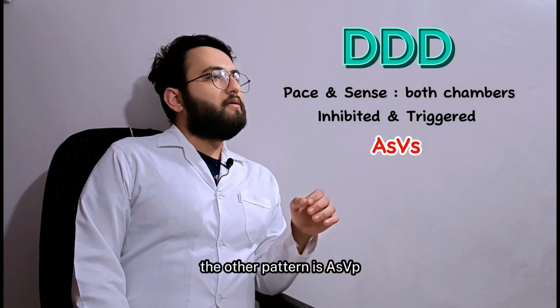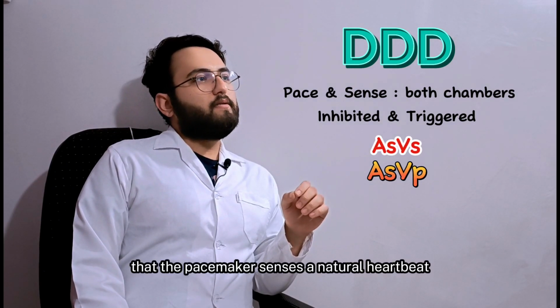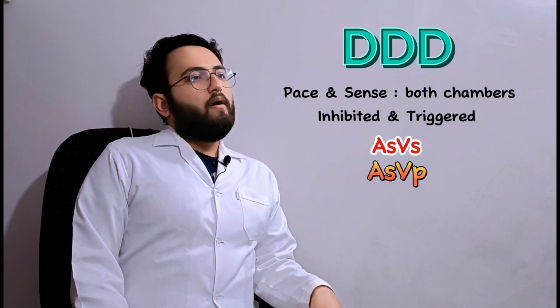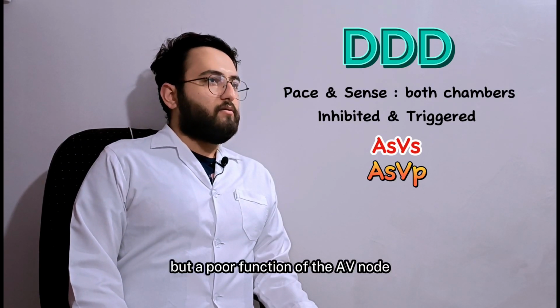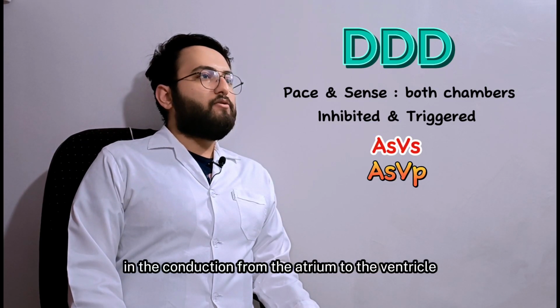The other pattern is ASVP. This means that the pacemaker senses a natural heartbeat in the atrium, but it paces the ventricle. This is used when the patient has a good function of the sinus node, but a poor function of the AV node, which causes a delay or a block in the conduction from the atrium to the ventricle.